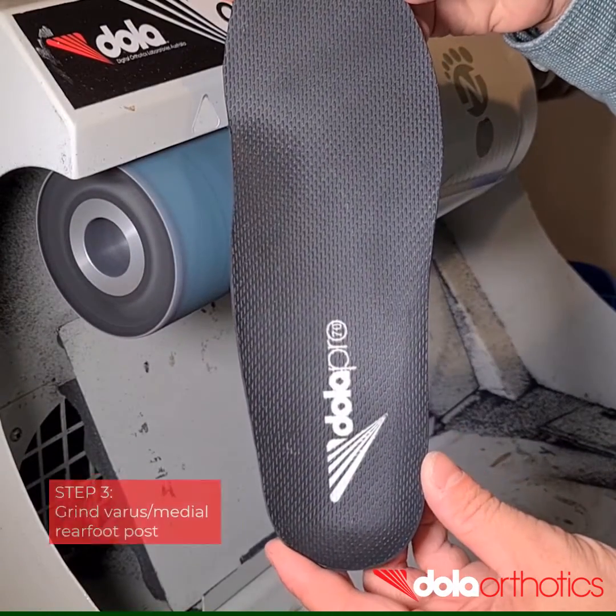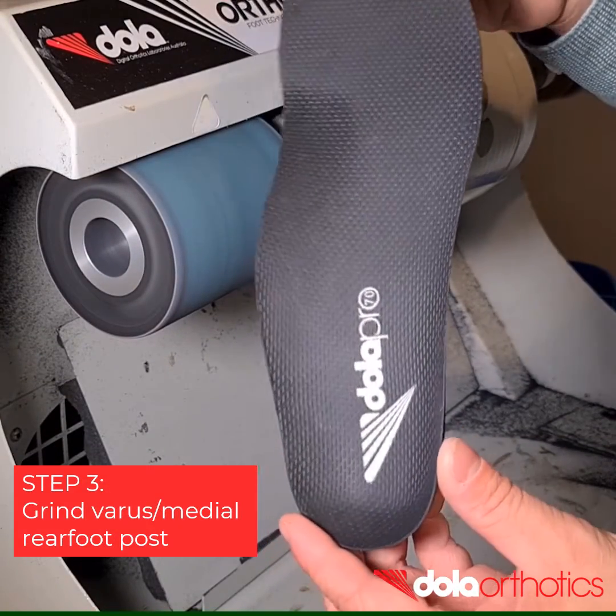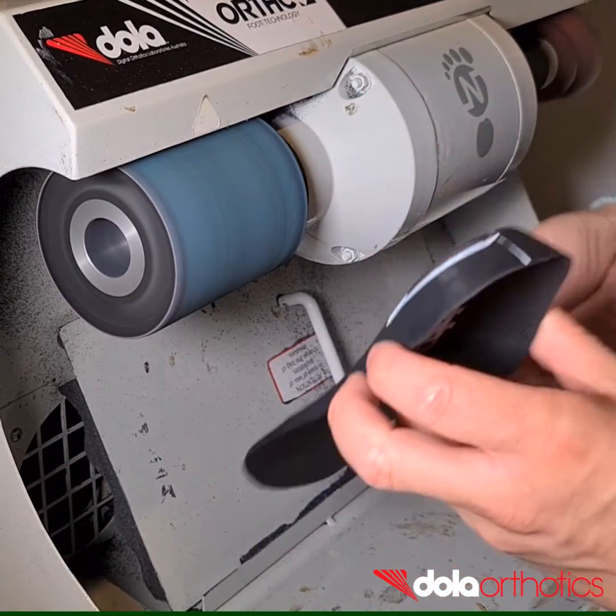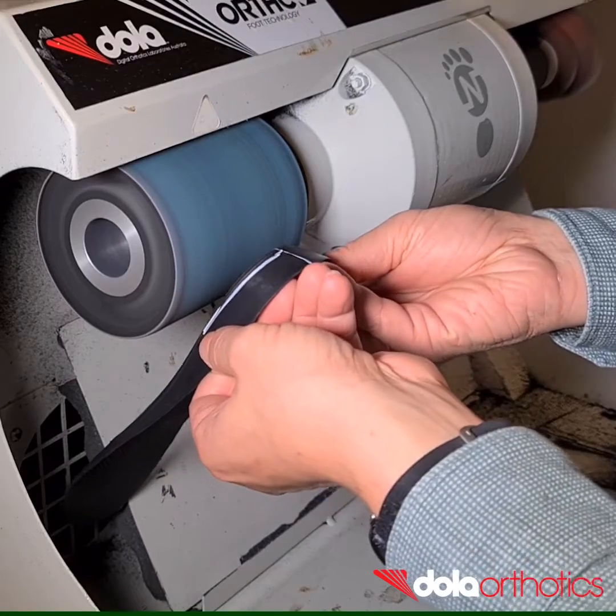The aim of grinding is to remove the orthotic shell material from the lateral heel up to your guideline and blend it at a gradual angle to the medial side, leaving the medial border untouched.